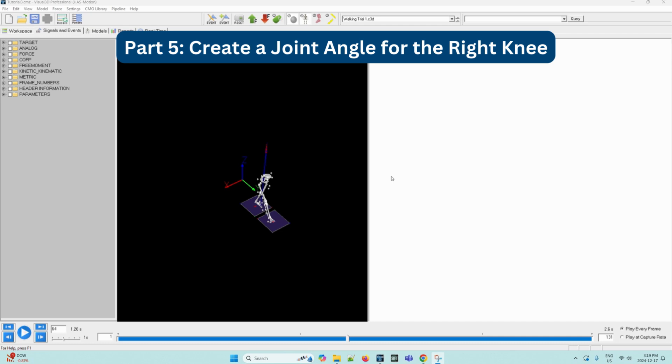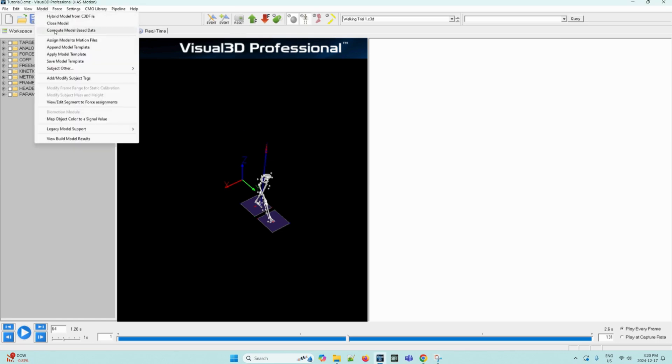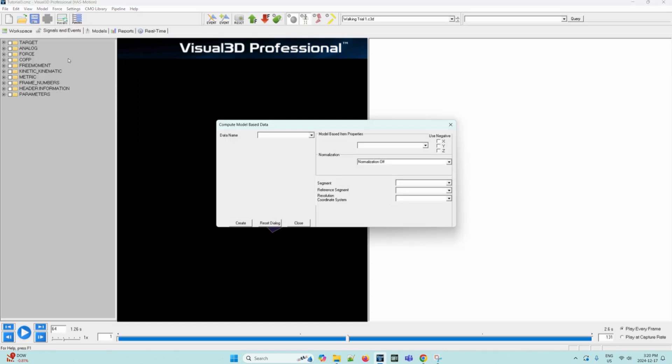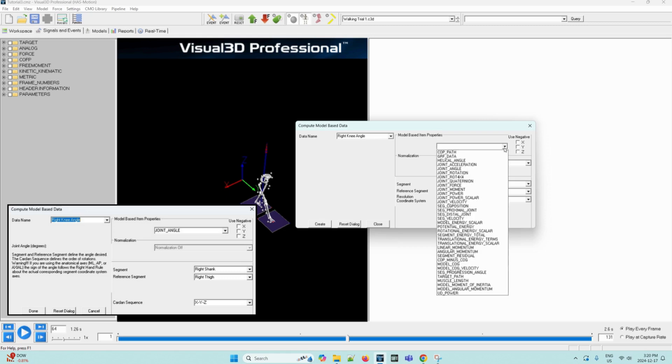Now we can start on creating a joint angle for the right knee. In the application, from the model drop down menu in the main menu bar, we can select Compute Model Based Data. This will prompt the following dialog box to appear. The information needed to be entered will be displayed in the image. In the data name box, we can create a joint angle called Right knee angle.